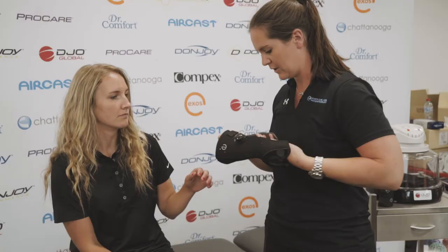It's messy, it's hard to use, can't take it on and off. It's a really great thing for us with the EXOS in the Northern Beaches. Our patients come direct to us in clinic — they don't need to go to the hospital. We can get the splints on there and then.